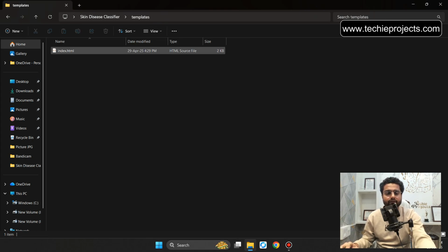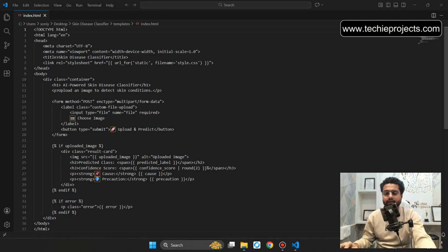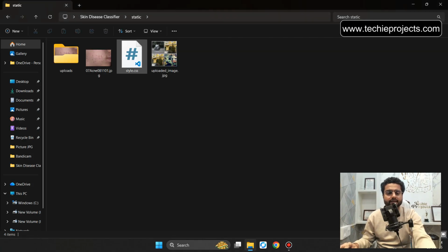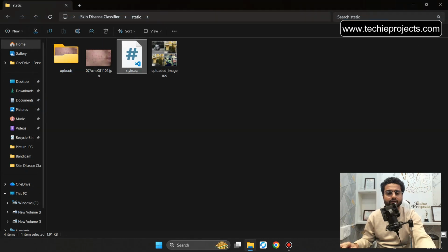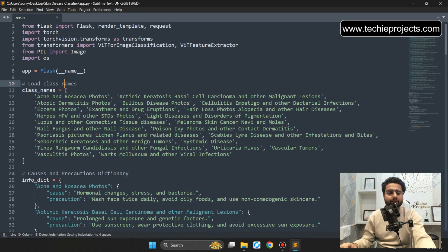This will be the templates folder, like index.html. It contains the HTML code, and this will be the CSS file, style.css. Let's close. Now this will be the app.py file, like this will be the main file.